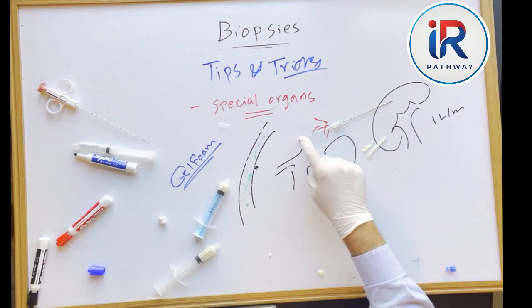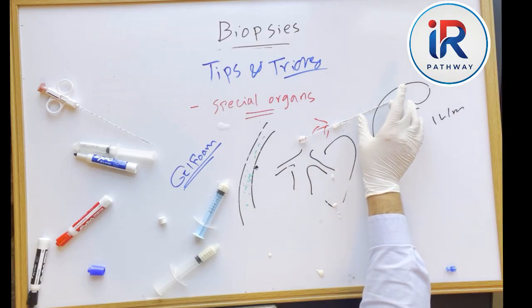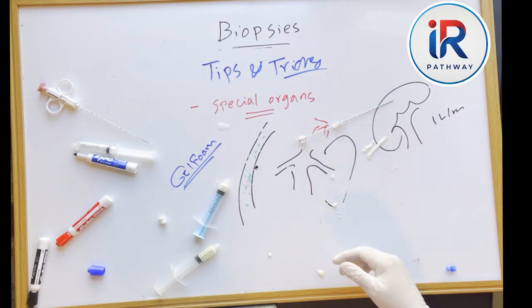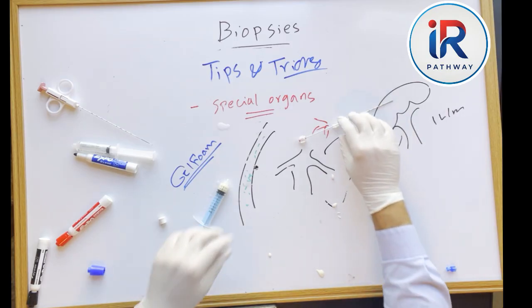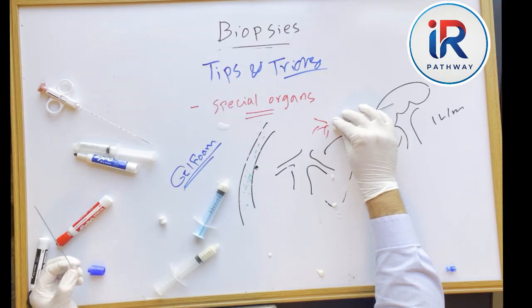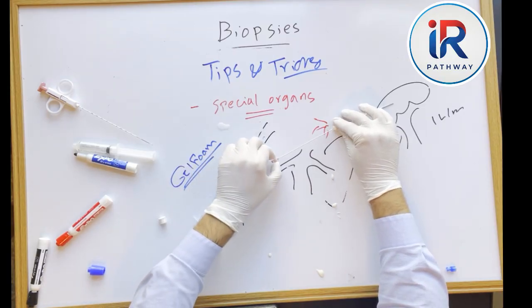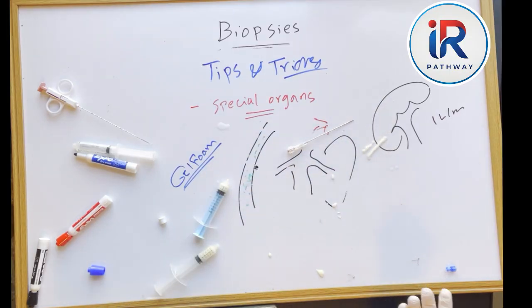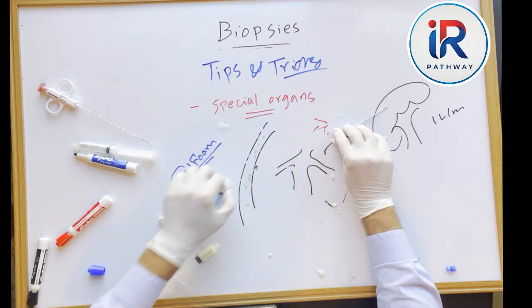This allows clotting to occur within the needle lumen itself. Over time, complete clotting occurs, and when you remove the needle, there is no active bleeding. In this case, you can simply advance the formed clot inward and then withdraw the needle.